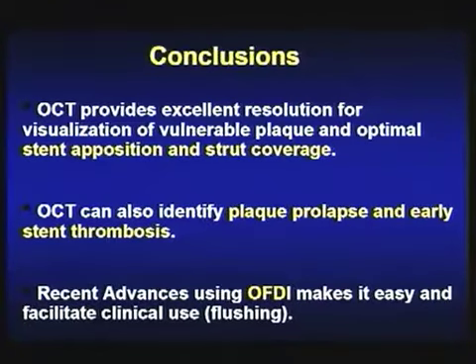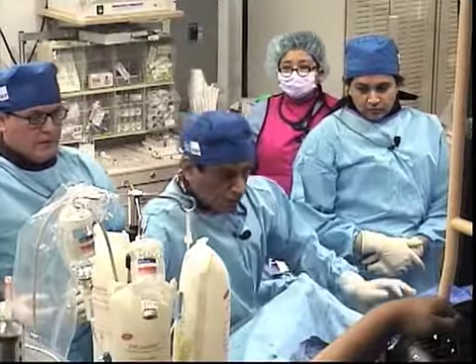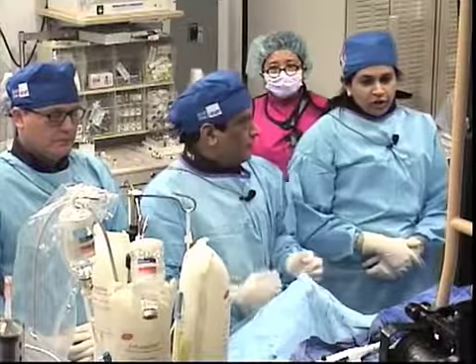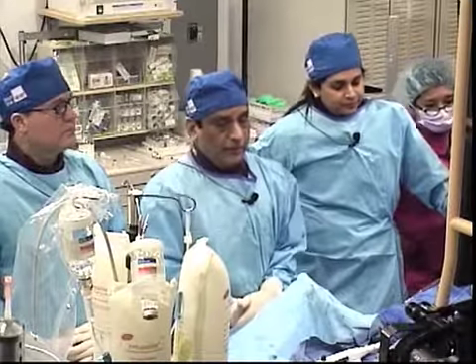And the recent technology that obtained FDA approval, which all of us can use in the cath lab, is optical frequency domain imaging, which can give you 5 centimeters in one pullback with one flush with excellent imaging. No flushing, huh? Yeah, that will be a very important point, because one of the things you saw is that you had to give so much flush to get better visualization. It's a dye. Dye, yeah. I mean, flush with the saline or dye, a lot of dye needs to be given for these cases.